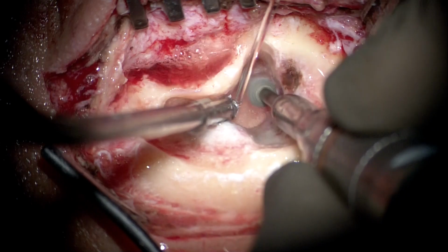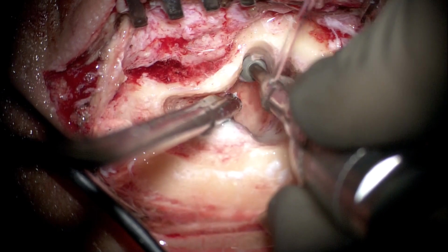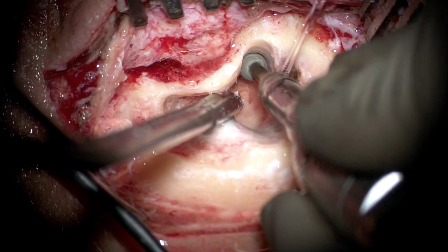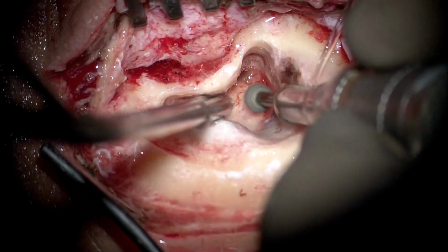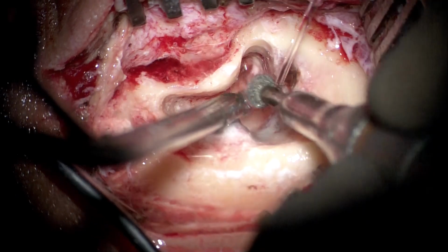We are drilling the tegmen fossa dural plate using a large diamond burr anteriorly to posteriorly and also towards the sigmoid sinus, so that we are able to maximize this exposure of the sinodural angle.